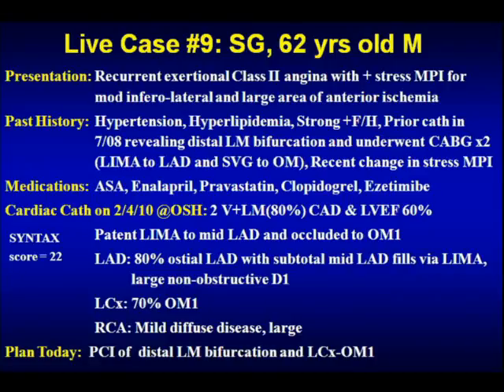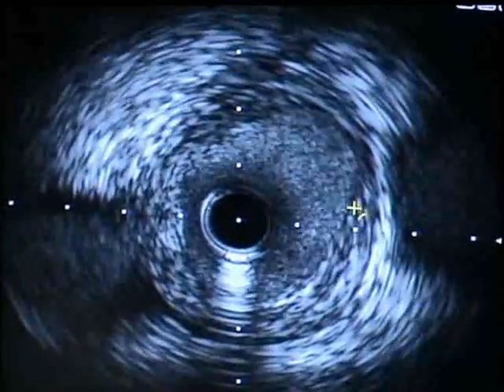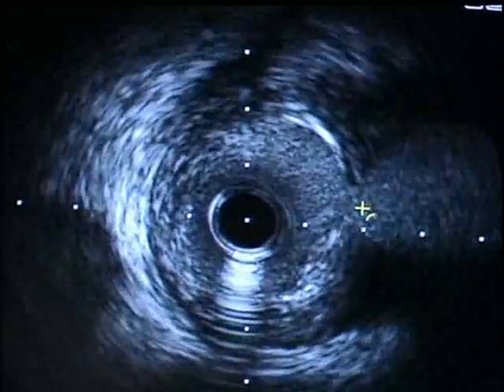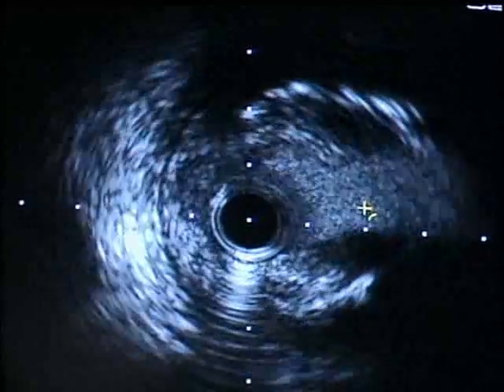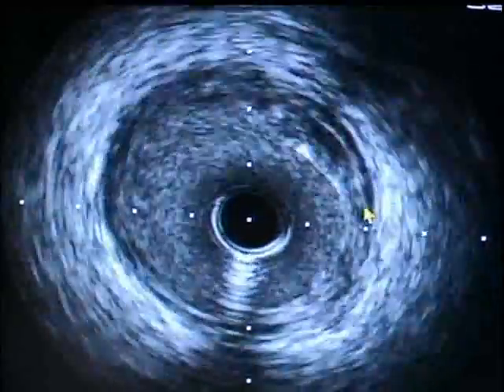Yeah, so this is from the distal, we are coming proximal. As you see, there is mild to moderate disease in the entire OM that we first saw, and two branches of the OM. Okay, this is that small branch. We keep coming proximal. Let it play. It's not difficult to see frame by frame like that. Yes, okay, we see it very nicely now.